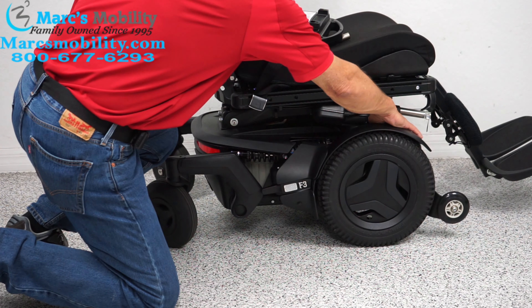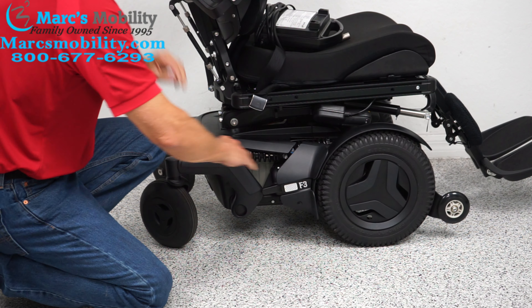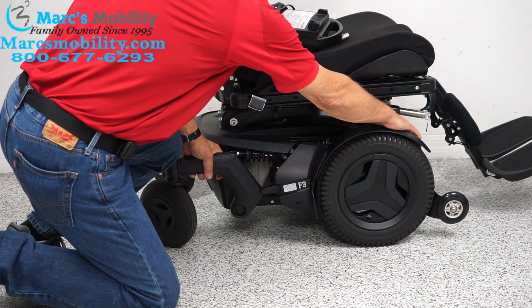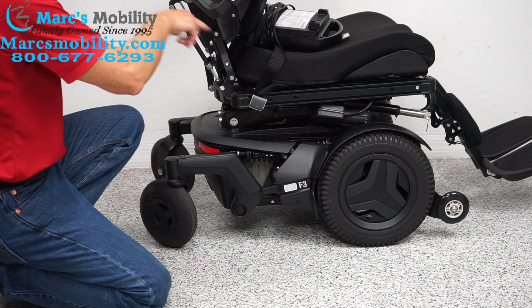There's an anchor point here — you can't see it, it's behind the fender — and there's another anchor point behind the fork. This is where you tie your chair if you're going to transport it on a vehicle, on a lift, on a trailer, whatever. There are four anchor points all around the chair.